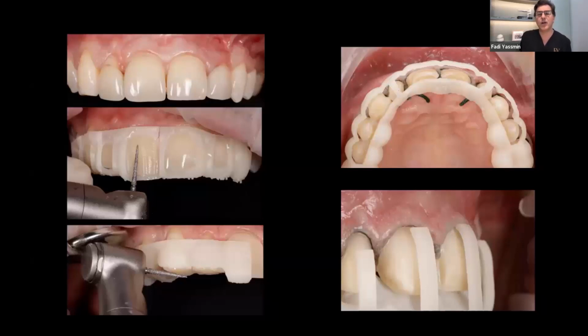And in fact, what I do is, because they are a bit delicate, the girls do 2 builds for me. So they'll do one that's ready and they'll just do a backup one. Because sometimes you take them on and off, they break, you don't have to stress about it. So I will have 2 ready to go. It's not a big deal. Sometimes I use it, sometimes I don't, but you just have it ready. So you don't have to be as delicate, because some of these are quite delicate. So that's why I'll have a few spares ready to go.